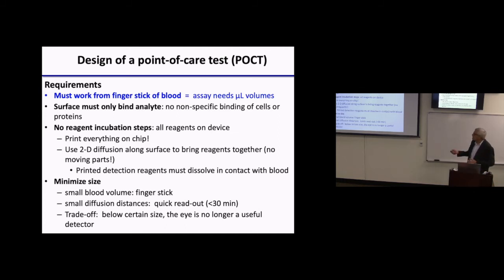The challenge to solve was how do we have all reagents in this device? So Angus is really smart. He was inspired by the LFA and put all the reagents on the chip itself. The LFA works by the principle of capillary flow, but we don't use that here. Instead, we bring everything together in time and space at the right time with diffusion along 2 dimensions, along the polymer brush. And I'll show you how that works. It will be reminiscent of the LFA.